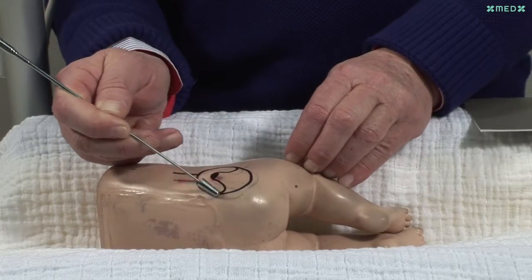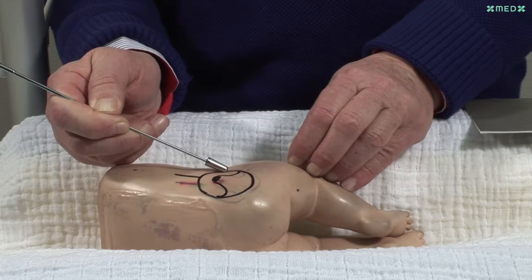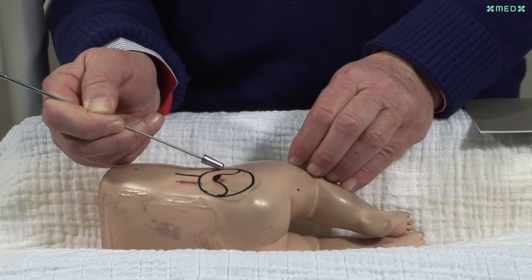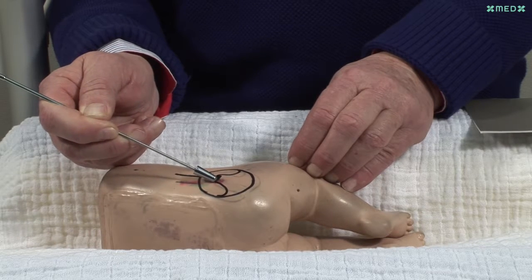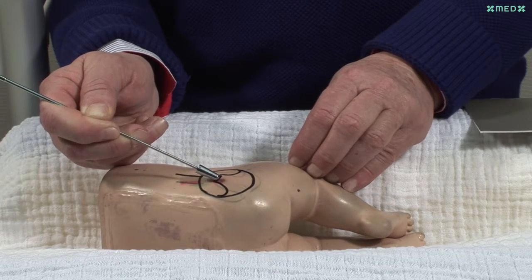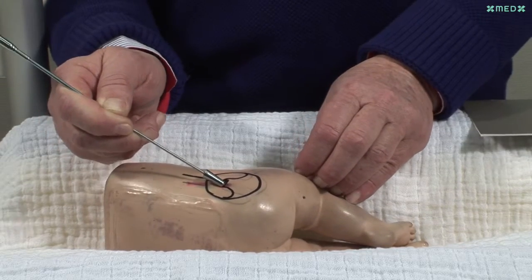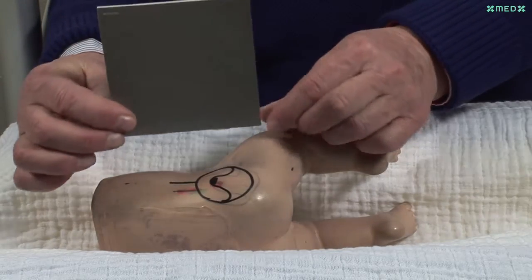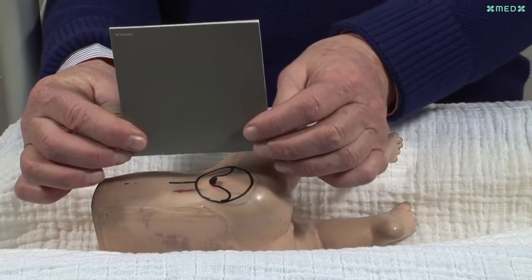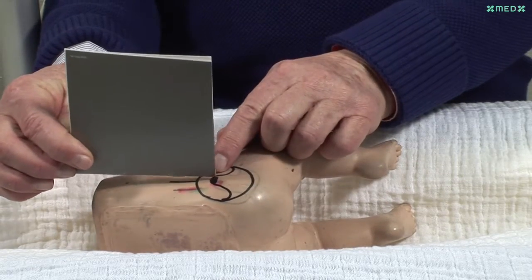Here we can see that the hip joint is very small, with a diameter of 1.5 centimeters. The center of the acetabulum is marked by the lower margin of the ilium, which is about 1-2 millimeters in size. Here we can see the ultrasound plane. At first it is important to find the lower margin of the ilium with parallel movements across the hip joint.